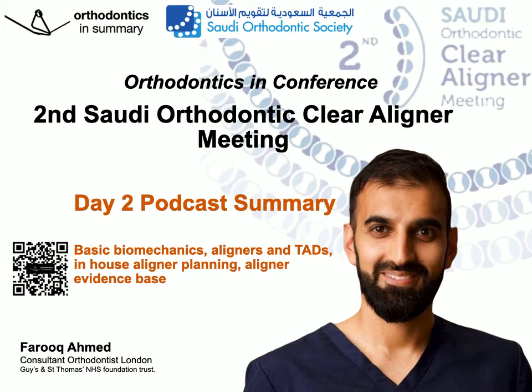He then showed a really interesting study looking at attachment design. So this was where they took a rotated premolar, put different attachment designs and positions of attachments onto that tooth and put that typodont into a water bath. And it was really interesting to see what they showed. This was by Mumtaz in 2017.